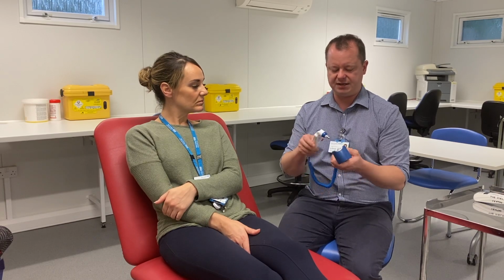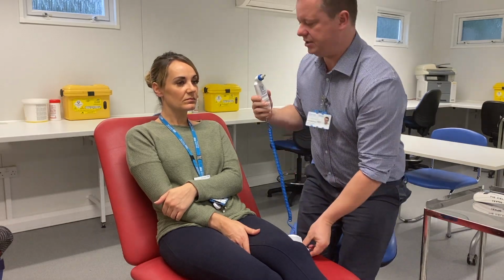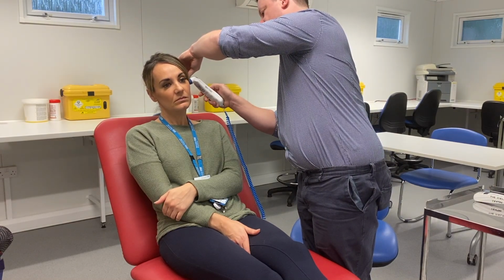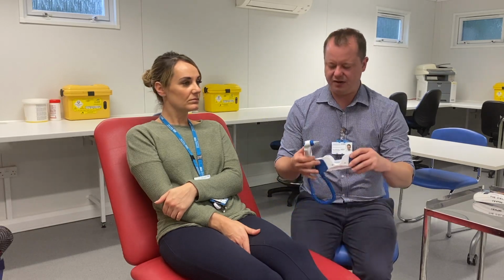So if we are going to take temperature, we can place our cover on our thermometer. When we do that, the thermometer turns on, and then what we need to do is just take the ear, brace the patient, pull it out and up, place it into the ear hole, and then we're going to press the button on the thermometer and we can take it out, and then on the thermometer we can actually see the actual temperature of the patient.